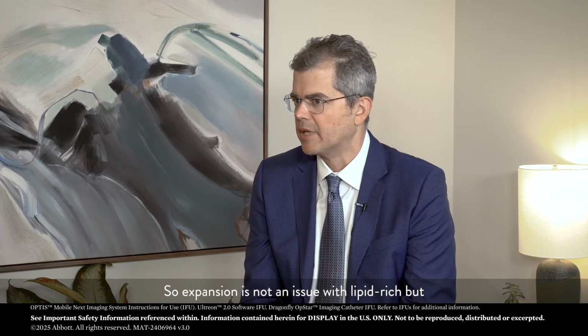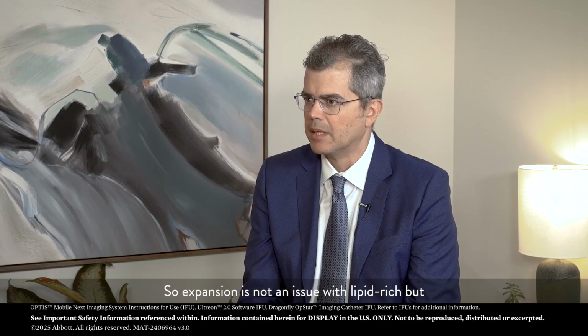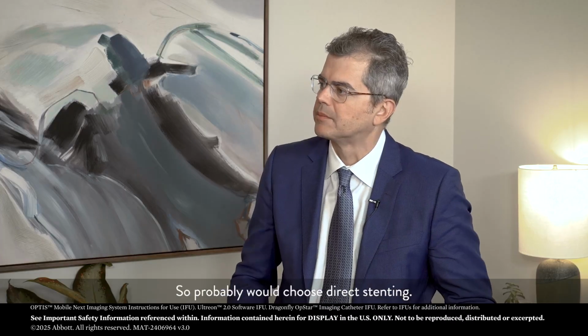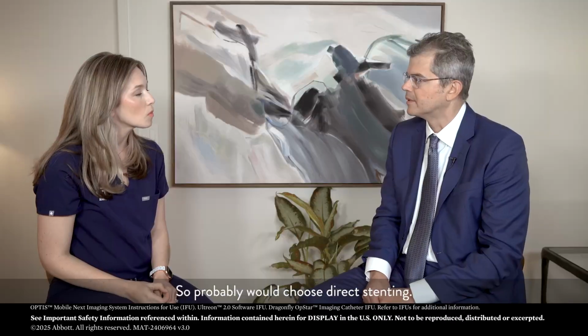So expansion is not an issue with lipid-rich, but there are reports of distal embolization of lipid-rich plaque. So probably I would choose direct stenting in that situation.